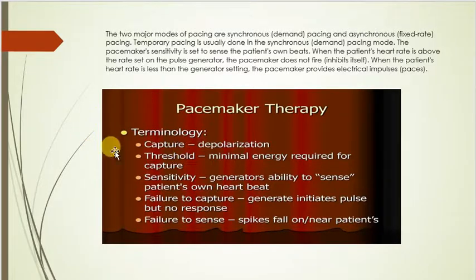And you'll hear some of this terminology like capture, threshold, sensitivity. We just talked about sensitivity, failure to capture, and failure to sense. So capture is actually, is it going to depolarize? Is it going to have enough amplitude, enough energy to the heart to be able to say, hey, we need to send this electrical impulse down the heart to give me one good complex here. And in the next one, if the heart doesn't, the settings say the rate so much, then boom, it's going to hit you with another one.